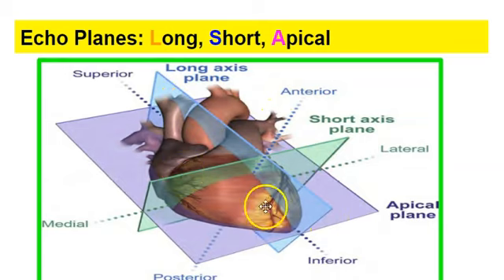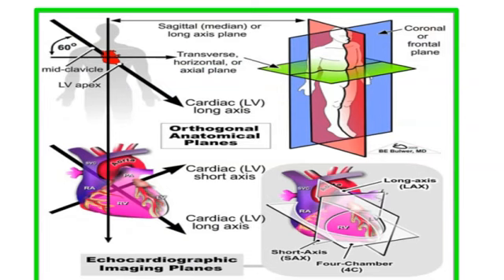And we have the apical plane, which comes right up through, if you would, just, excuse me, coronally, if you will. This would be transverse, but coronally and sagittally, straight through the heart is basically how we image the heart.